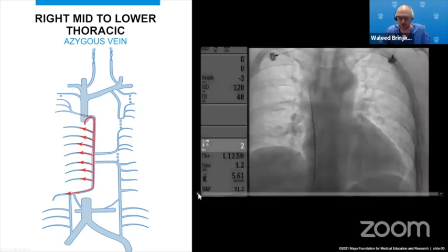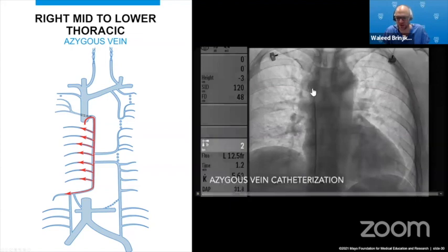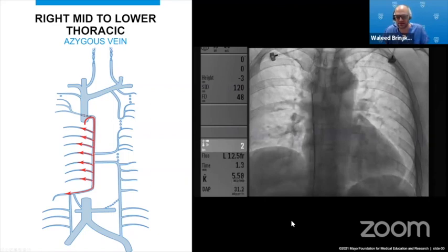So here, I'll show a case of embolization from start to finish. I have a 6 French catheter here, a benchmark, and then here I have a diagnostic catheter. The azygous vein entry is always right above the right main stem bronchus. So trachea, left main stem, right main stem, and this density here is the azygous vein. I'm going to play the video, and you can see here I have my catheter pointed posteriorly, and I'm inserting my wire into the azygous vein.